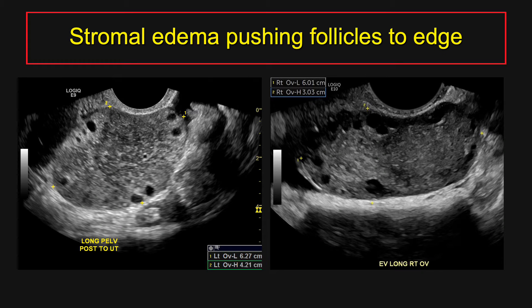The next morphologic finding is stromal edema, which pushes follicles to the edge of the ovary. These are two different cases of ovarian torsion proven at surgery. On the left image, you'll note the central stromal edema within the ovary which pushes the follicles to the edge, and very similar morphologic findings in the right image involving the right ovary — again, stromal edema and peripheralization of the follicles.